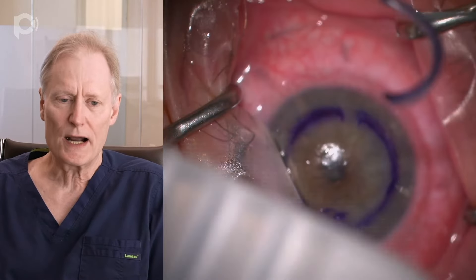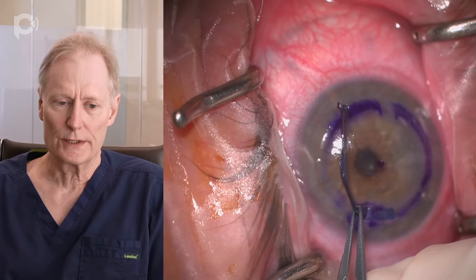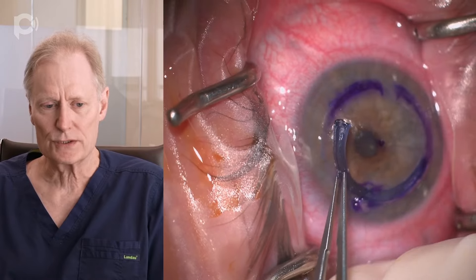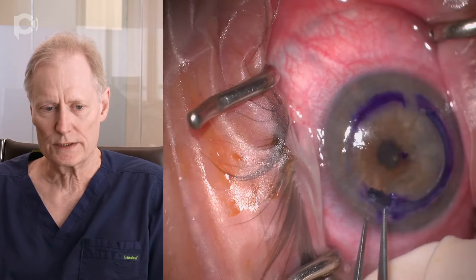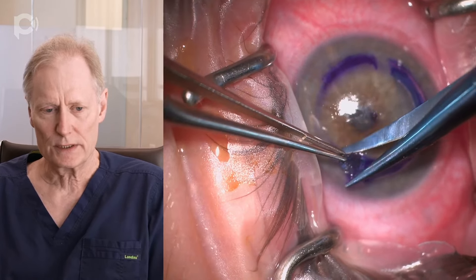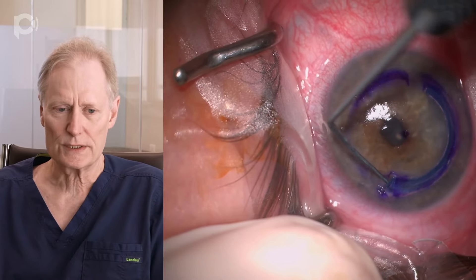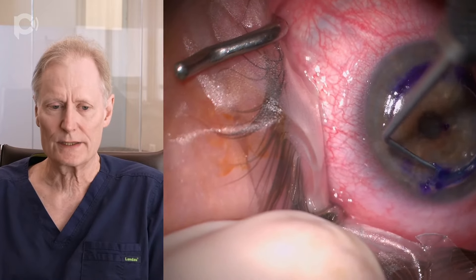The segments are dried so they're very easy to insert and we just thread them in. When they're dried they're actually thinner than the intact segments so they thread right in. This one has not been trimmed so I'm going to trim it before I put it all in. It's a full 180 degrees so it's a little bit longer than this channel, so we'll just trim off the edge of it and tuck it in. But this is pretty much the whole procedure. Patients don't have near as much discomfort with this as they would with cross-linking and generally patients see significantly better the next day.